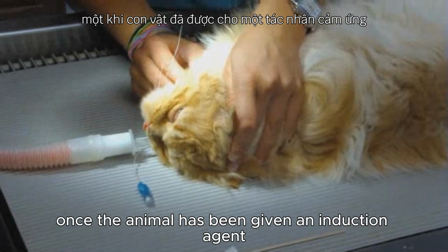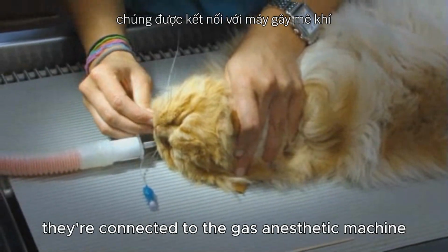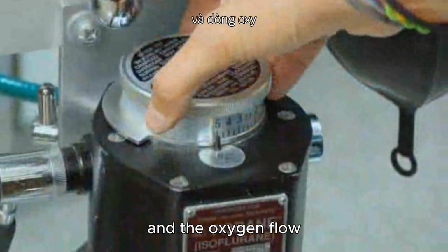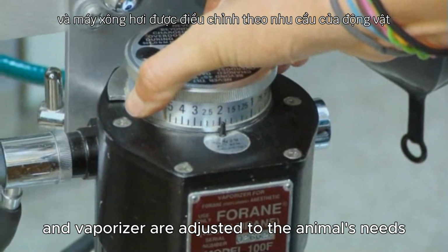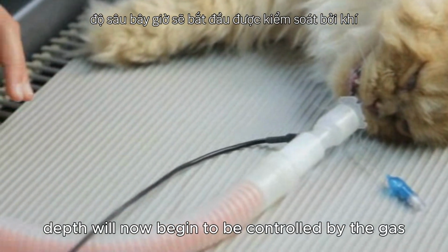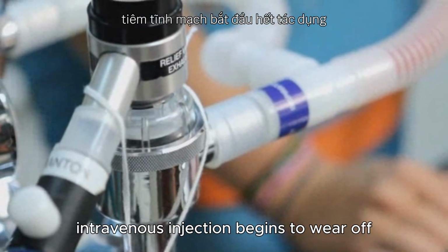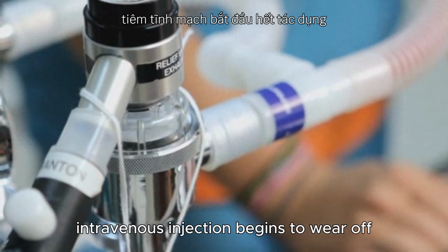Once the animal has been given an induction agent and intubated, they're connected to the gas anesthetic machine, and the oxygen flow and vaporizer are adjusted to the animal's needs. The animal's anesthetic depth will now begin to be controlled by the gas from the vaporizer as the effect of the initial intravenous injection begins to wear off.